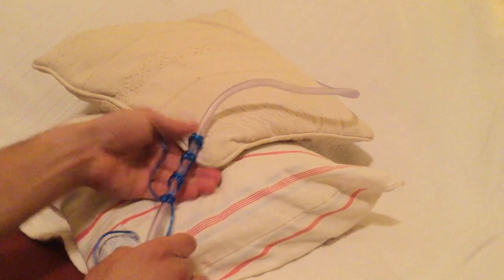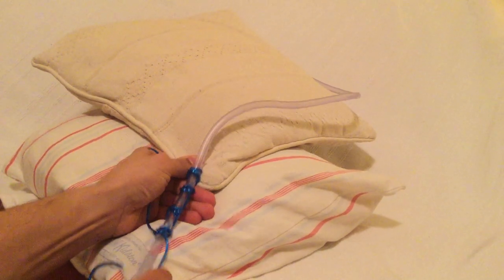And we can finish this one off with a standard reef knot, and we have our secure drain. This is not going anywhere at all.